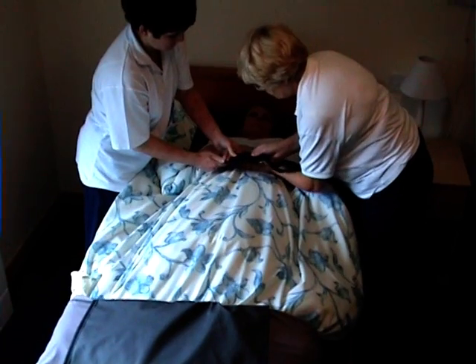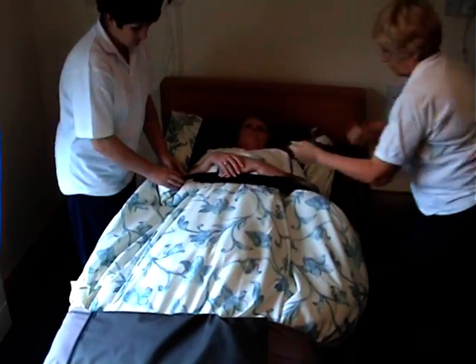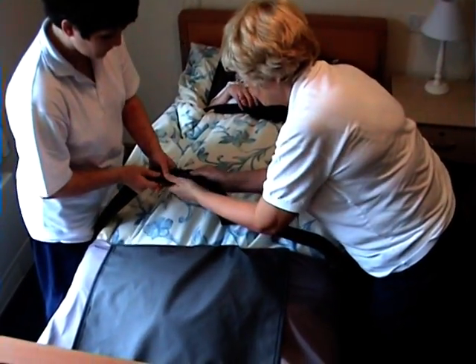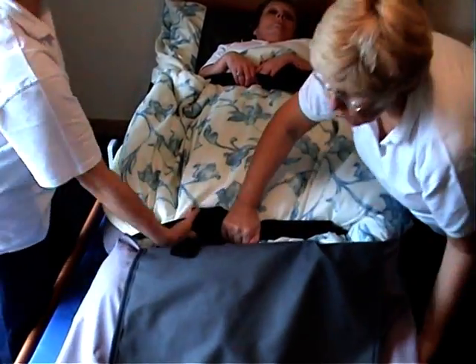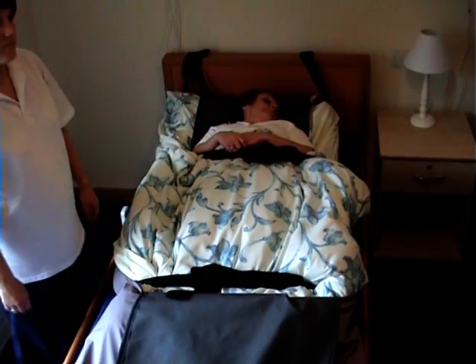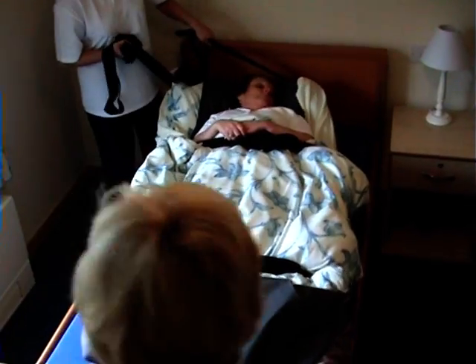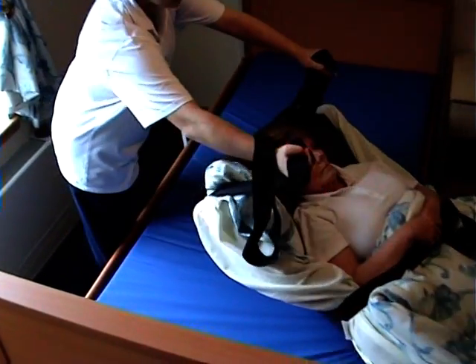Fasten the straps over the legs and tighten. Fasten the straps across the chest, ensuring that the service user's arms are over the straps. With one carer at the top and the other at the bottom, grasp the straps of the ProPad and cross them ready for turning. Now in a controlled manner, turn the ProPad so that the service user's feet are facing the door. The carer at the foot end moves backward, bringing the ProPad to the floor.